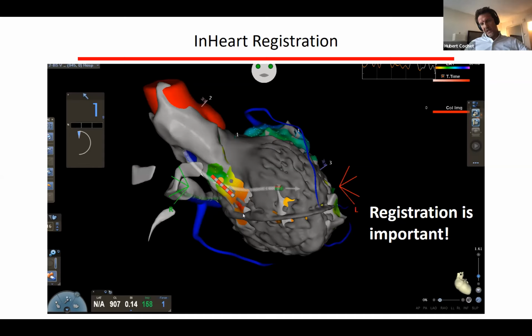Another thing is, when not going retrograde aortic, when going transeptal, one very important message is not to register on atrial geometries. The atria are much smaller at this end diastolic phase than what you will get on electroanatomical mapping. So one very accurate approach when going transeptal is to map the pulmonary artery and the 2 pulmonary arteries, its main branches, because then you have a rotation that is fixed. And it's quite fast to acquire.